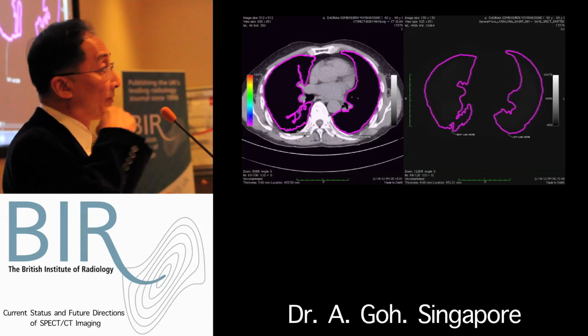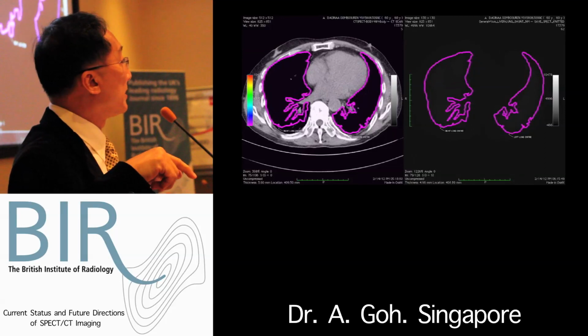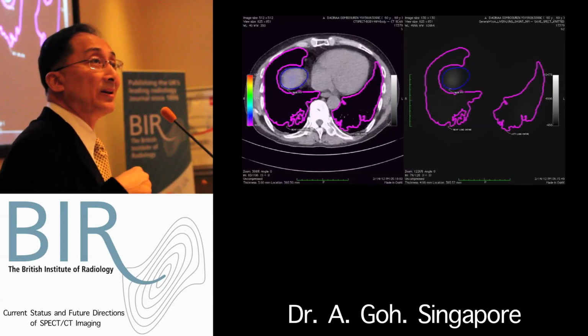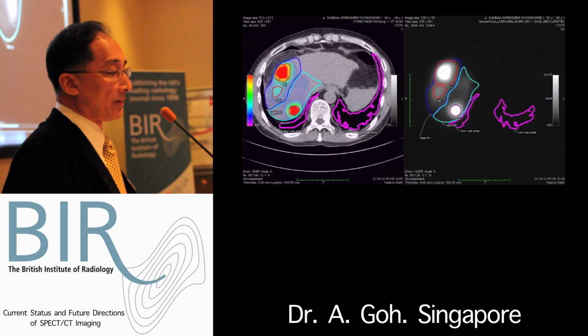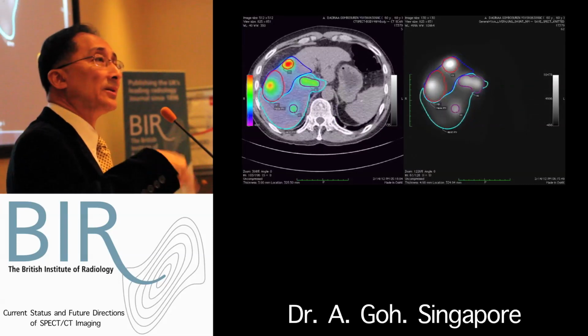And anecdotally, I just wanted to tell you that generally our patients have much smaller lung masses than 1,000 grams, and this work calculation goes down into the tumor masses and the lobes as well.